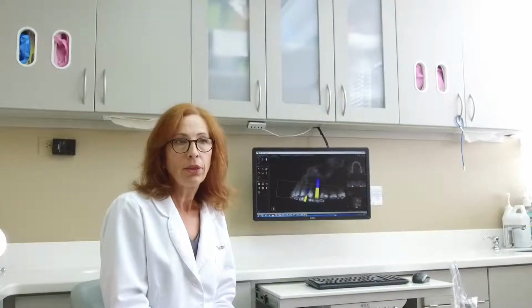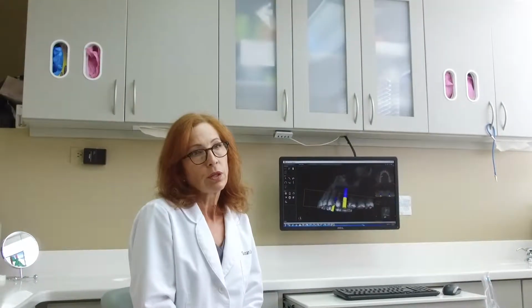Certainly we all see ads on TV about teeth in a day, and those are generally not for single teeth. Those are often for people who need all their teeth taken out, and they're going to put in a screwed-in set of teeth on the implants. So it's a little bit different than when somebody has to lose one tooth. All in all, you want the implant placed properly with good bone support. If the implant is done properly, then it should be stable and healthy and look good cosmetically for many years. So it's important to do it correctly.